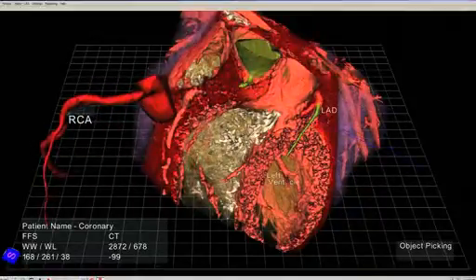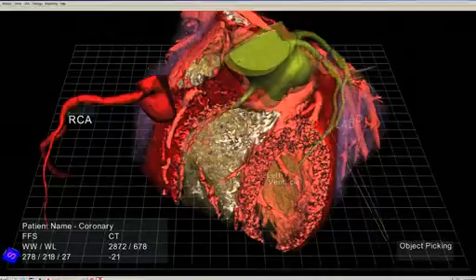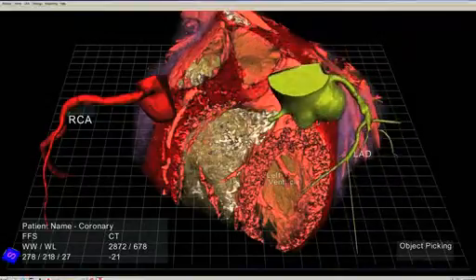These vessels are sub-millimeter, and the newborn patient is the size of the palm of your hand. So they basically get imaged, and we use our software to help the doctor understand the curvature of the vessels, follow the vessels all the way through the lungs, and determine which vessels need to be surgically repaired.